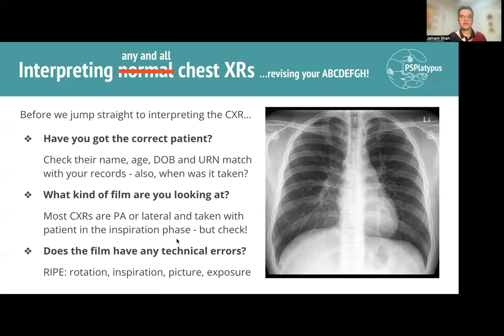And then finally, any technical errors. So in a similar way to ECGs, where you're looking for the calibrations, you're looking to make sure that the line itself is isoelectric.